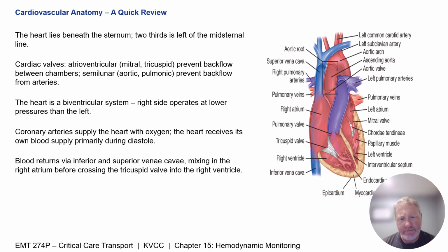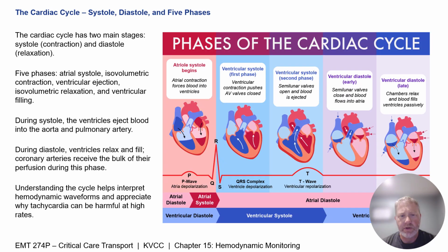Understanding the blood flow through the heart is very important when you have a patient who's on hemodynamic monitoring, so that you can understand the values and how they differ, and the waveforms and the actual purpose of each of the lines. Let's take a closer look at the cardiac cycle and its phases.